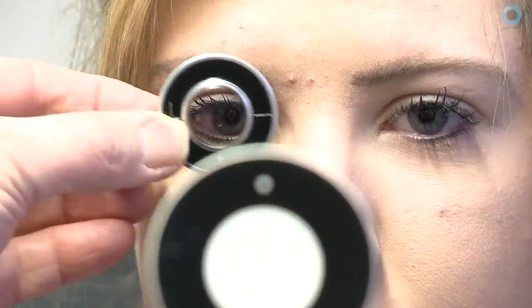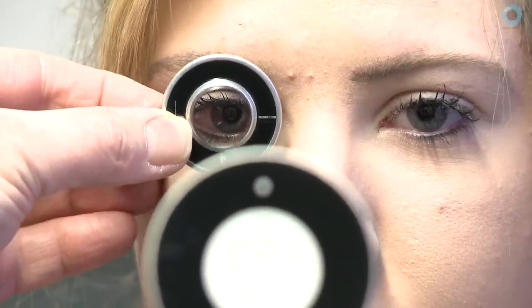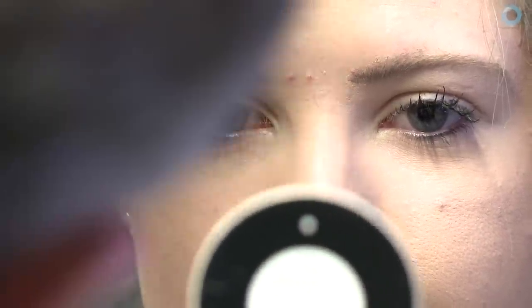When the prism goes in, you should see the eye under the prism move inwards a little bit. And when you remove it, it should actually reverse and move outwards again. And if you don't see any movement, just do it again to make sure that you are certain of what you're seeing.